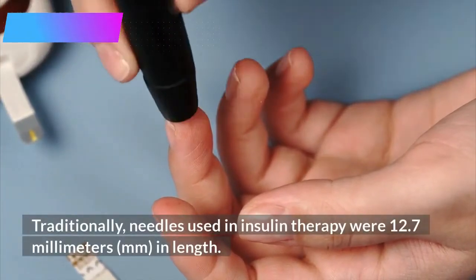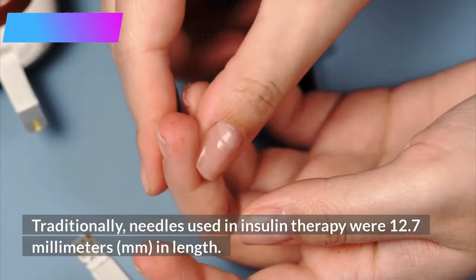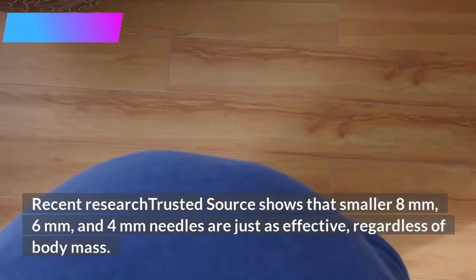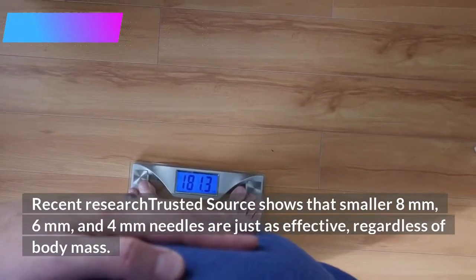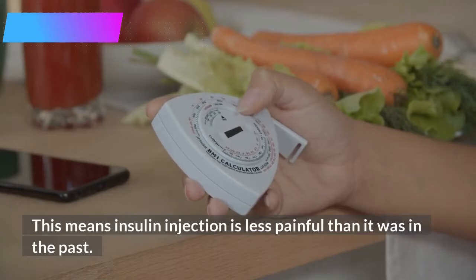Traditionally, needles used in insulin therapy were 12.7 millimeters in length. Recent research shows that smaller 8 millimeter, 6 millimeter, and 4 millimeter needles are just as effective, regardless of body mass. This means insulin injection is less painful than it was in the past.